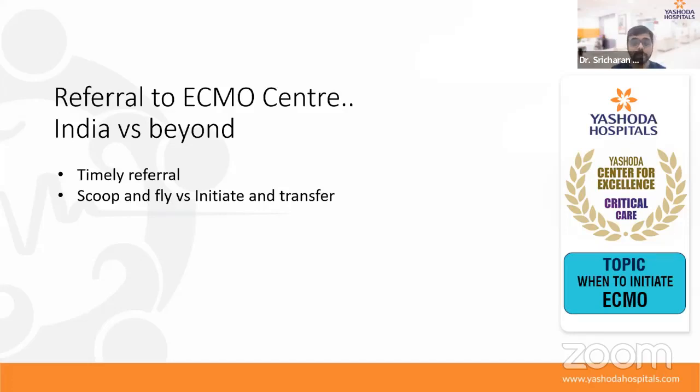Of course, this particular patient's data has been considered and analyzed in the randomized trial as intention to treat analysis. However, they did not go out of the hospital to place ECMO in a remote center and bring the patient to this ECMO referral center. However, right now we have the abilities and the infrastructure which is enough for us to go to a remote center where the patient is receiving conventional mechanical ventilation, initiate the patient on ECMO, and then get the patient back to the ECMO center.